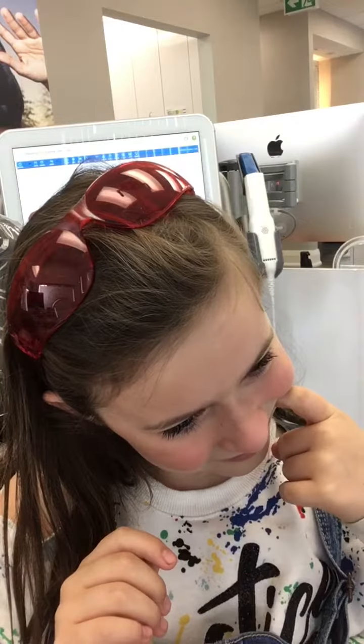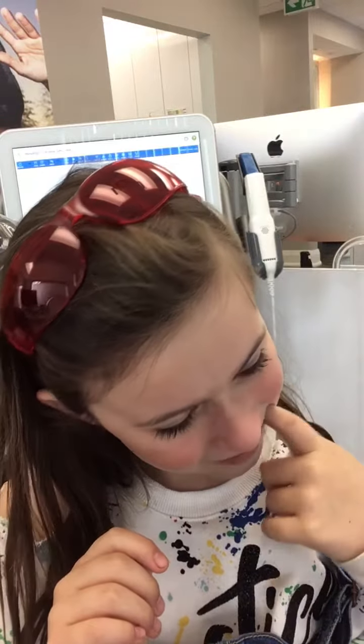Now a little trick here is to take them out, because I just added little latches or little bumps to your teeth. You've got some wiggly teeth in there, so I know it's going to be a little bit careful. Good job! I hear it — click, click, peel. Maybe use the other finger, it's easier access on the inside.